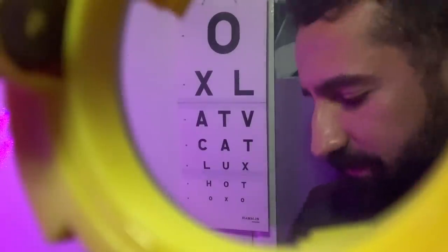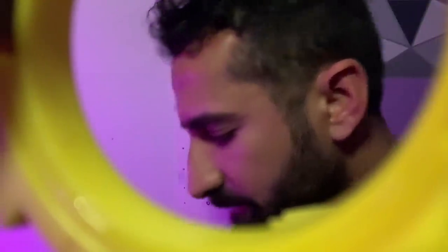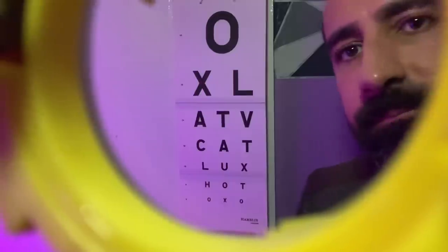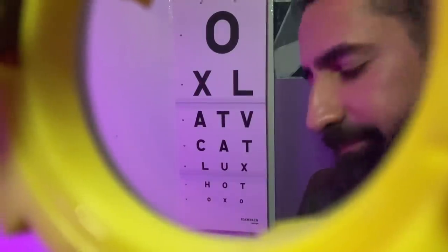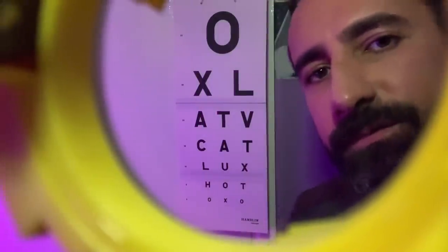Okay, we can reduce the sphere in the frame there. That's fine. So we've landed on a minus 0.50 diopter sphere there. Excellent. Okay. Now we're going to move on to some cross cylinder.